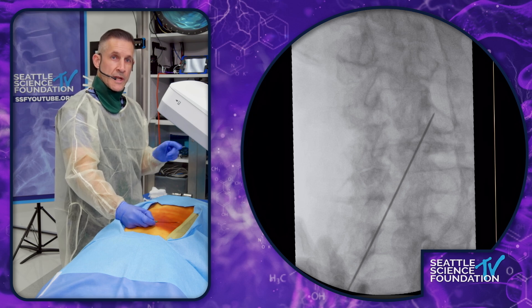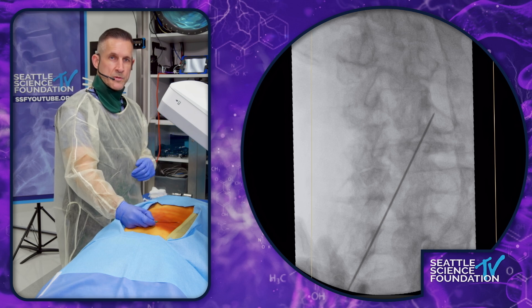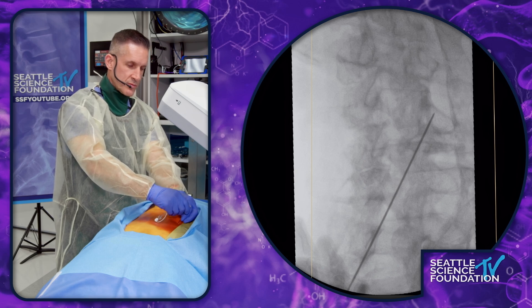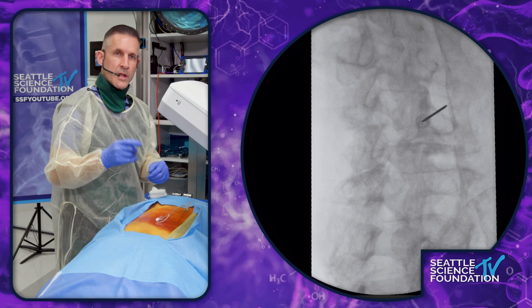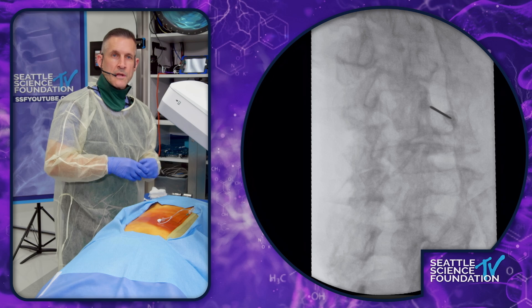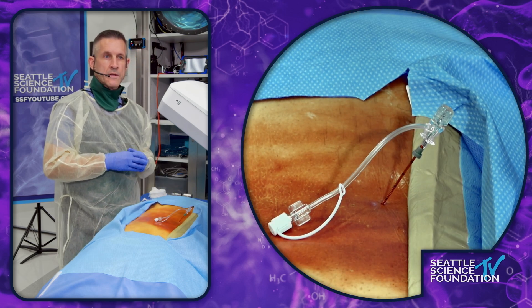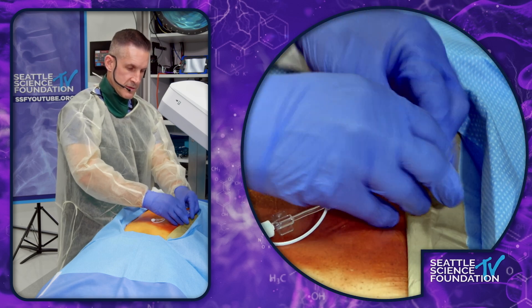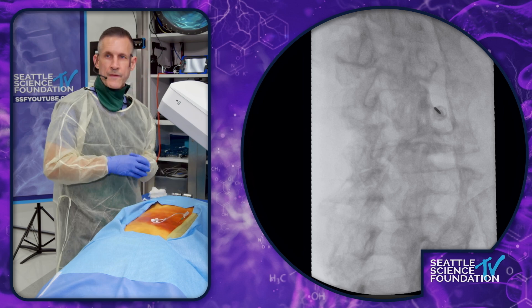You can see just to the left and upper is the superior articular process, and going to the right is the transverse process. So basically I'm just going to come right down in a perpendicular fashion, which is really nice with this. I'm going a little bit too far lateral, so I'm just going to angle just a little bit more down the tube. And I'm going to walk this down until I get down to the bone. Should be getting pretty close to bone right now — and there's bone right there.